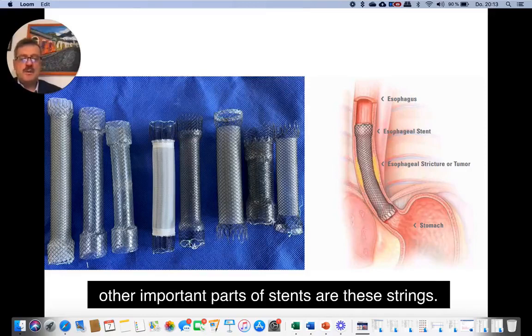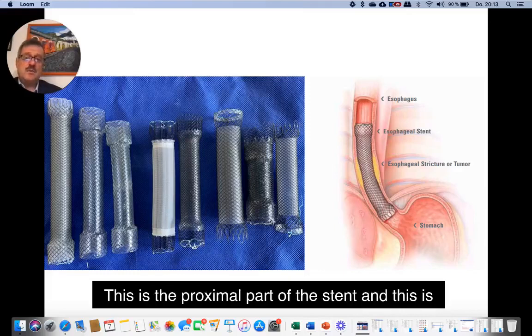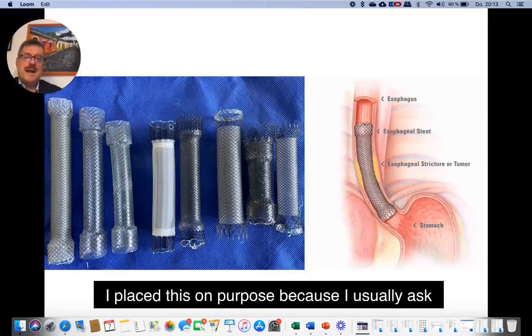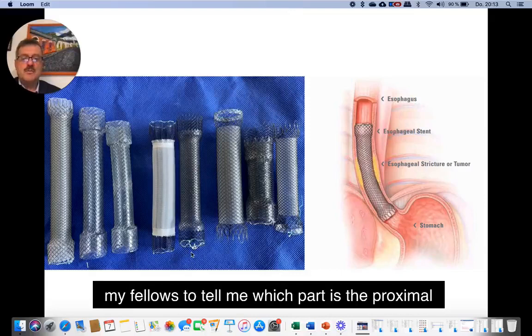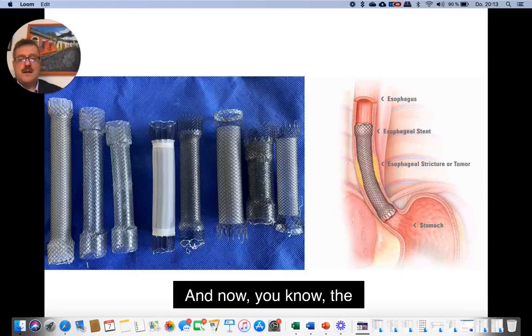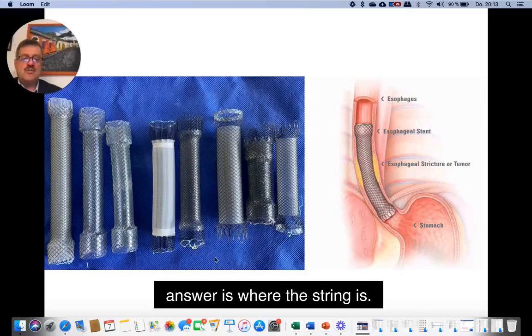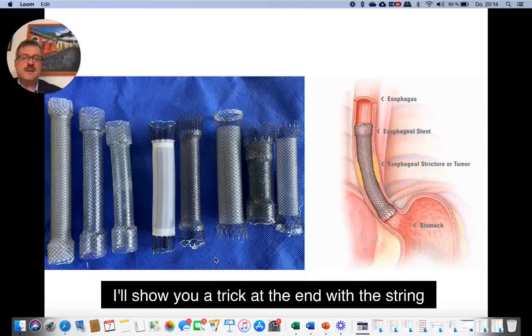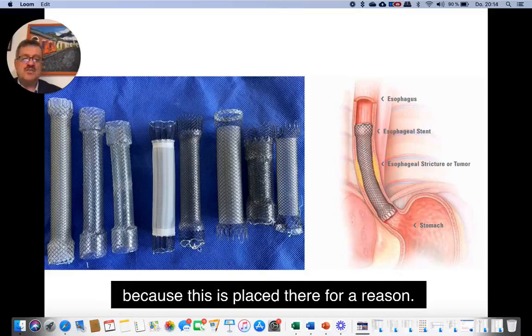Other important parts of stents are these strings. This is the proximal part of the stent — I placed this on purpose because I usually ask my fellows to tell me which part is the proximal part of the stent, and now you know the answer: it's where the string is. I'll show you a trick at the end with the string, because it's placed there for a reason.